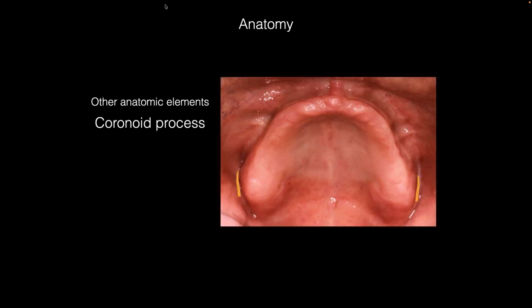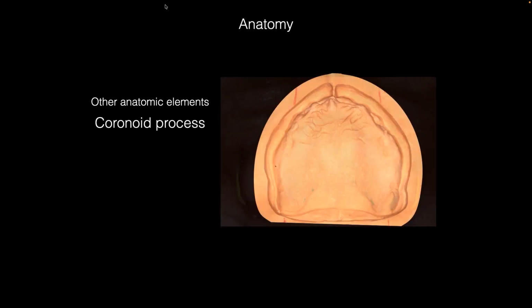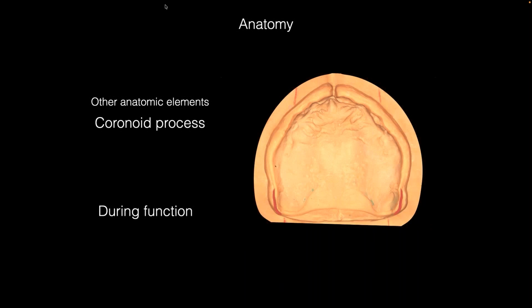Okay, this is where the coronoid process lives when the patient opens. And you see it on the master model. So during the function, there it is, opening the mouth or moving the jaw from side to side.